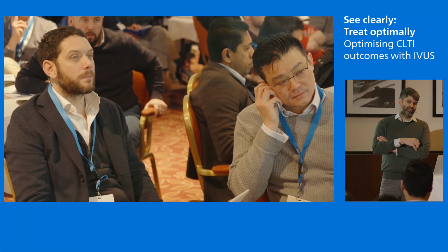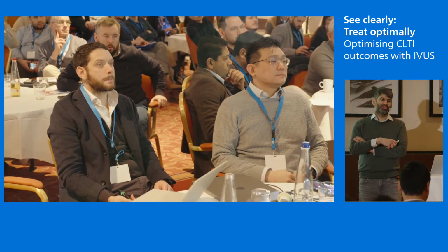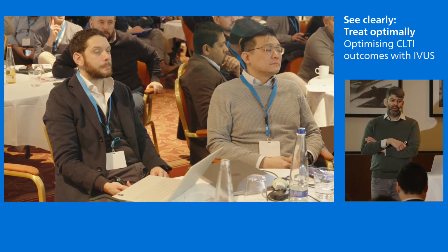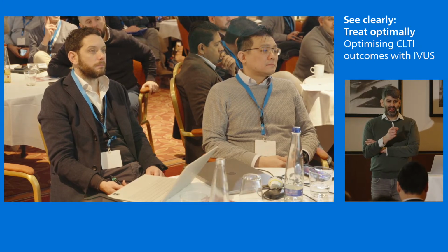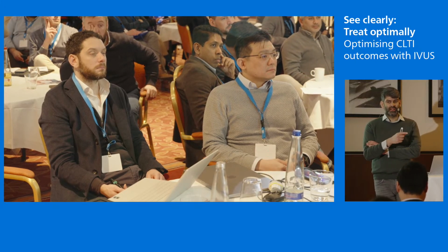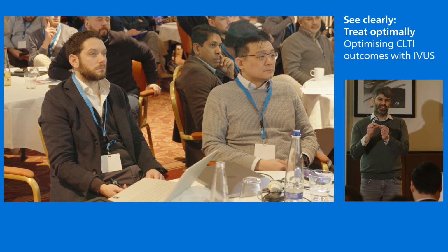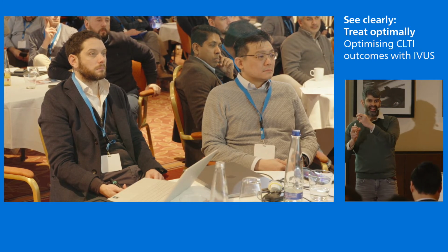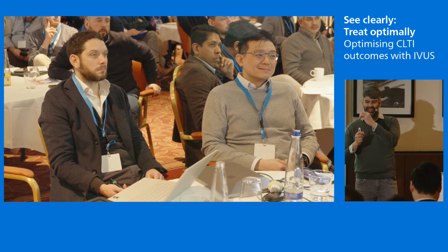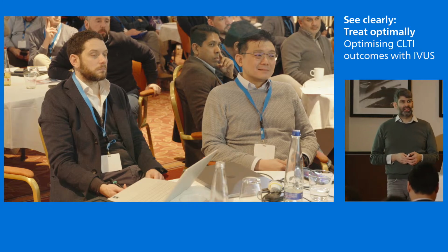I think it depends very much on the morphology of the calcium. If you've got circumferential calcium, I would need a very good reason not to post-dilate. However, there are certain lesions where, particularly now as we're doing more iliac IVL with the larger devices, you can see those calcified plaques that are almost grabbing together two bits of the artery and holding them together with a little calcified clip. As soon as you IVL those, it just pops off and the vessel opens out. In those cases, maybe you don't need to do a plain balloon angioplasty.